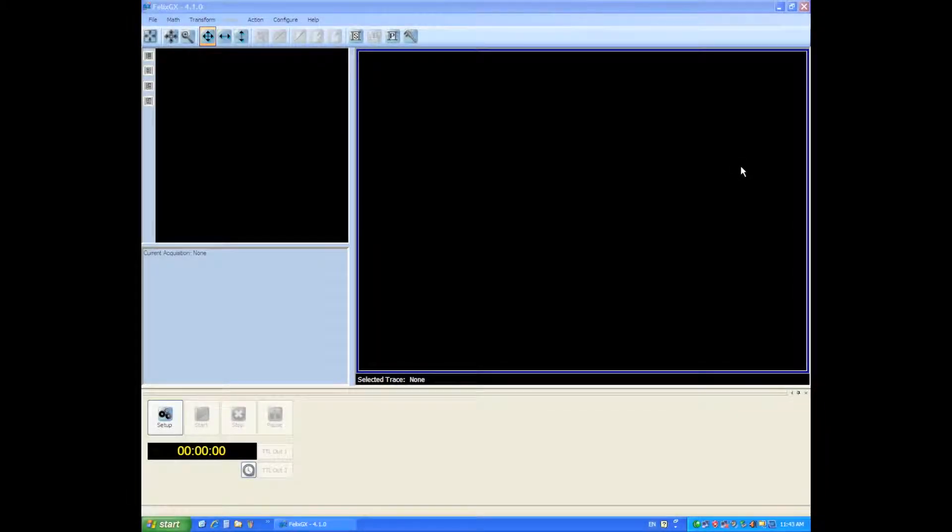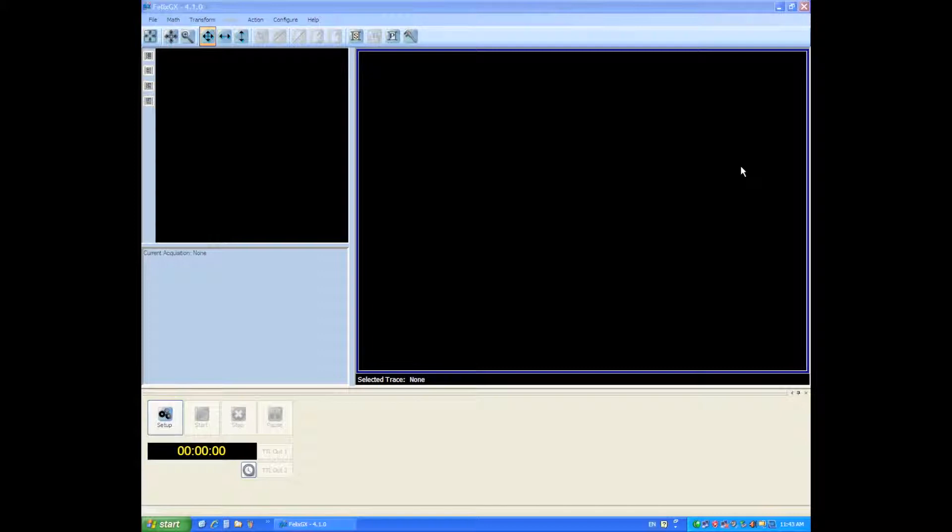Good day everyone. I'd like to welcome you to Felix GX version 4.1 where we'll be going through some tutorials on how to configure your instrument out of the box.